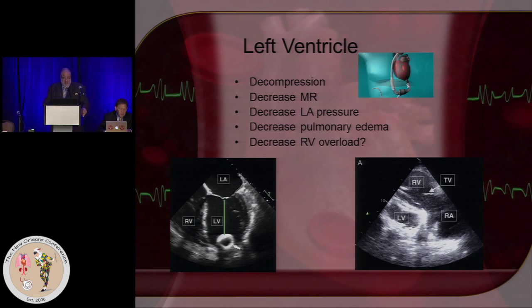And we'll get to that in a moment, but the idea is you want to avoid that. And many of us, and particularly in the early years, perioperatively, I used to try to have the lowest RPMs possible because I did not want this happening in the middle of the night when I wasn't in the hospital to pick it up. And so what I would titrate to is I had my CCO SVO2 Swan. If my SVO2 was 65, my continuous cardiac index was above 2.2 or so, I was happy. Whatever got me there, that's the RPM I set it at, to give me more of a safety margin with the RPMs. As the patient recovered further after surgery, we would titrate it based on echo. And I have changed my philosophy since that period of time, as we'll get to.